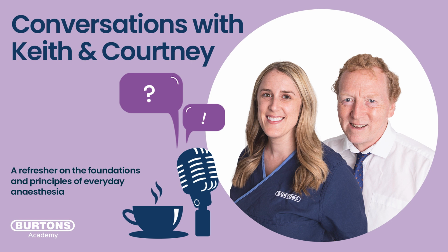So one of the first things I think people are going to say is pulse oximetry. And I'm going to say yes, but before we start talking about that, we should look at some of the fundamentals. How can we look at a patient and assess its ventilation and therefore imply its oxygen delivery and suitability? How are we delivering the oxygen? So let's just go on what we can see and what we can actually assess ourselves before we start looking at things like pulse oximetry. So let's lift up the lip and have a look at those mucous membranes, and let's see what we can tell there.